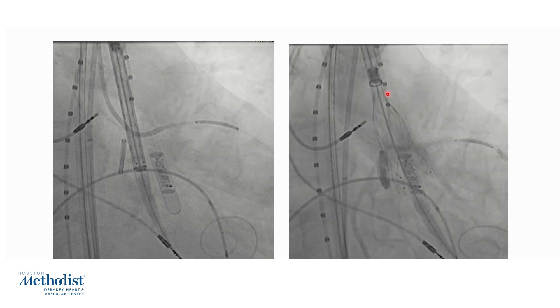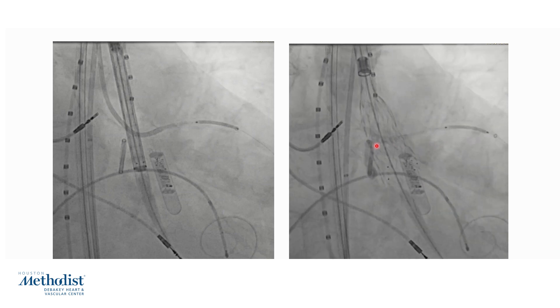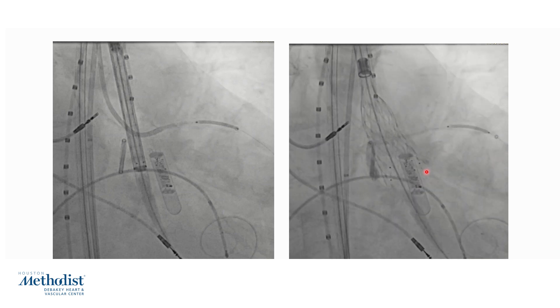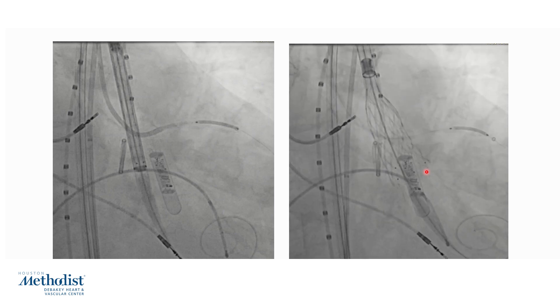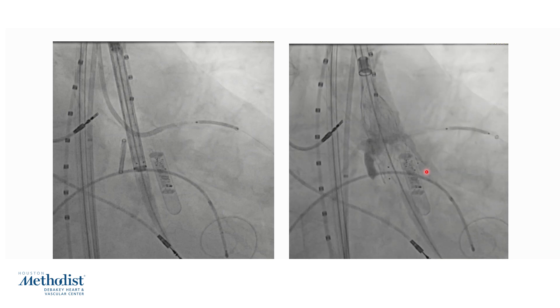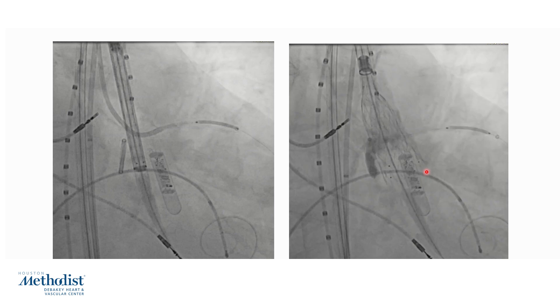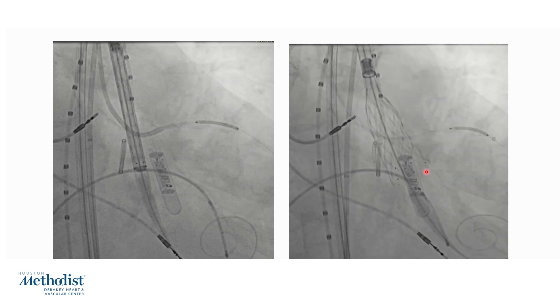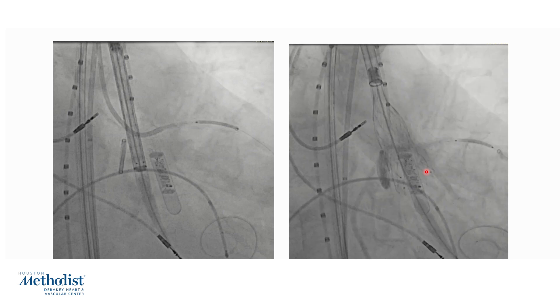We can see that coronary flow is not compromised — there is flow into the coronary artery in this view. As you know, the Evolute platform allows recapture. If there is concern for coronary obstruction or any other positioning issues, we can always recapture and redeploy this valve, making it a very good platform for these cases.